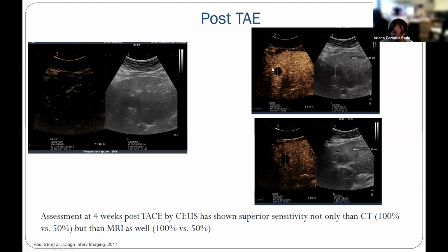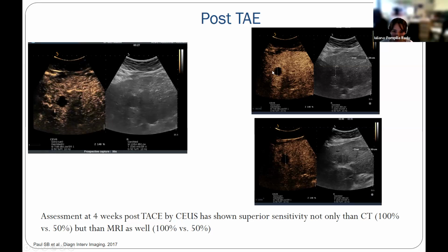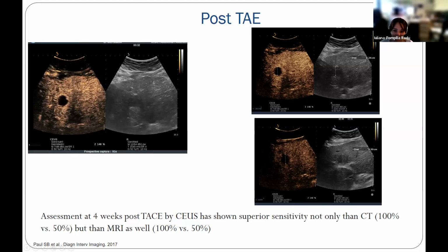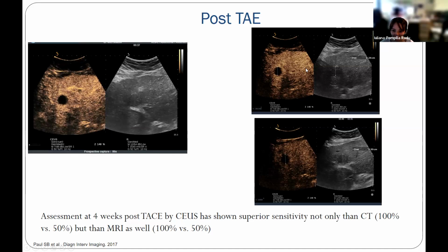What is very important is to know that there can exist a slight inflammatory area post-TAE. But in this case, we can have a slight washout, but the washout is not very pronounced. This was a patient that had a TAE, and we performed a contrast. We said that it is a rest of the tumor. An MRI was performed after that, and the MRI confirmed this.